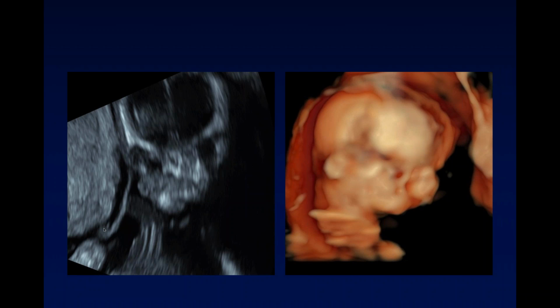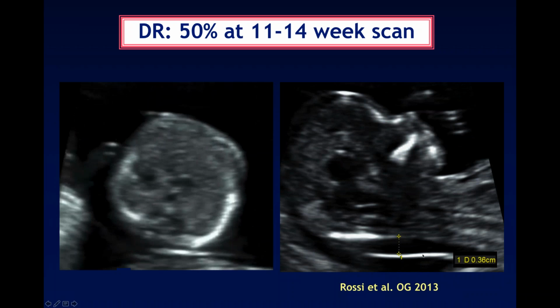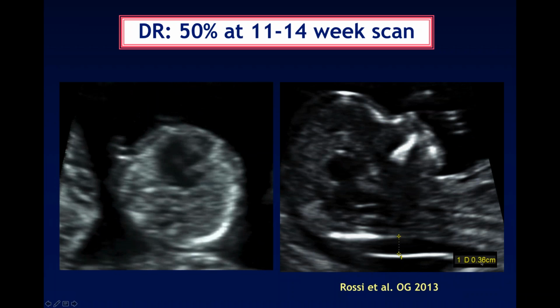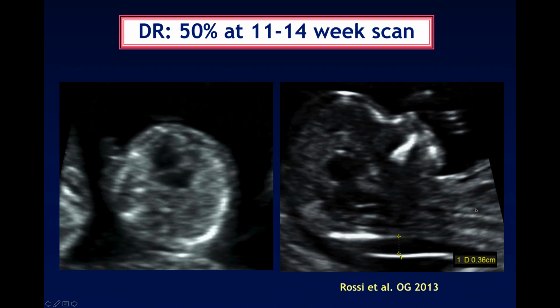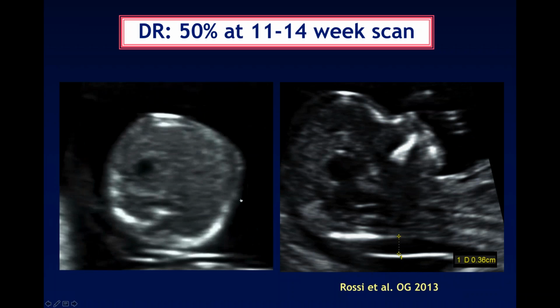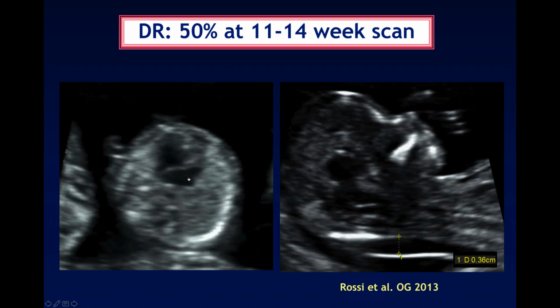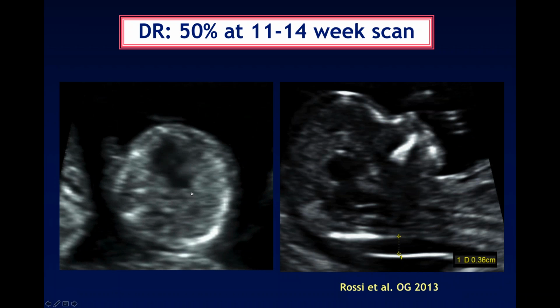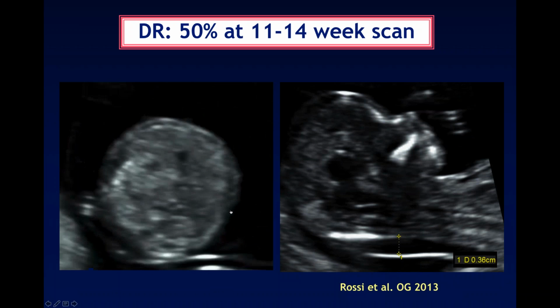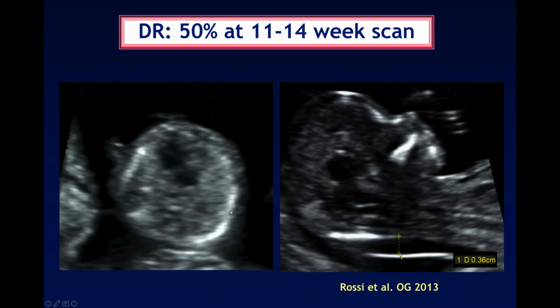It's another fetus where in a mid-sagittal view you get a very nice nuchal translucency. It's a little bit thickened, it's a little prominent, which should really prompt you to take a good look at the other anatomy. And here you can see in the same fetus an axial scan through the fetal chest, scanning through the chest, the heart, down to the stomach, and look at this four-chamber view. It's not symmetrical. You're missing the right ventricle. This fetus had a hypoplastic right heart, which you're picking up at approximately 13.5 to 14 weeks gestation.